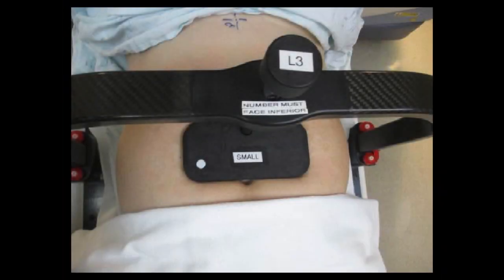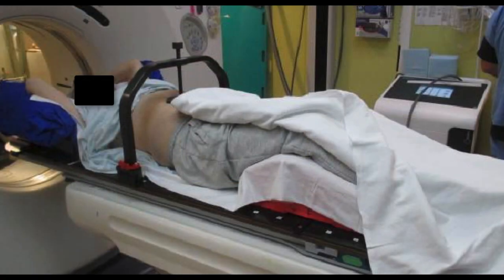Final technology is compression. So that is very simple. It might just consist of a device pressed, for instance, here against the patient's abdomen, and that limits the respiratory motion, or at least reminds the patient not to breathe deeply. And there's some value in having this in terms of reducing motion, and there have been quite a few studies on this.